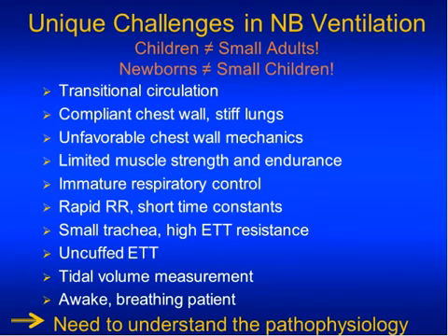They're little, so they breathe fast, and they have short time constants. And the ventilators need to adapt to that. Because of their small size, they have narrow trachea, narrow endotracheal tubes, and therefore high airway resistance. And that's particularly important when we ask them to breathe spontaneously through those narrow tubes. We use uncuffed endotracheal tubes, which means there's almost always a leak, which importantly affects how we can measure tidal volume. And that's an important aspect we'll talk about in some detail later on. And to make things more exciting for ourselves, we allow our babies to be awake and breathe, as opposed to the heavy sedation more commonly employed in adult and pediatric ICUs.